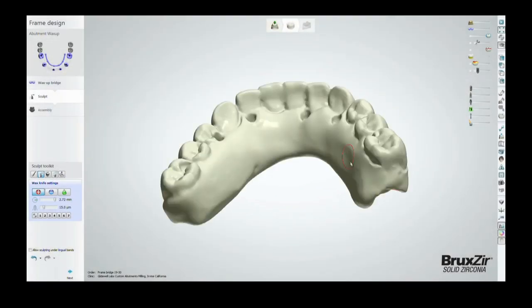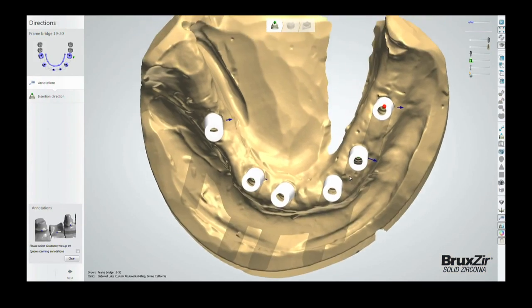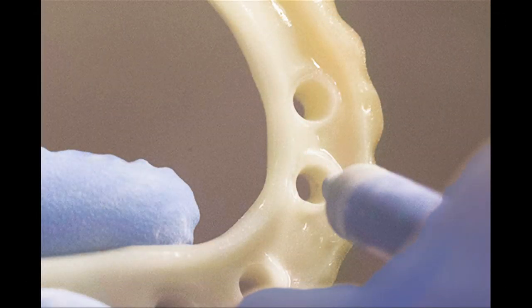Due to the CAD-CAM design process, the alignment of the inserts along with the fit and bite of the provisional do not typically require adjustment. Next, the provisional prosthesis is sandblasted in preparation for staining.